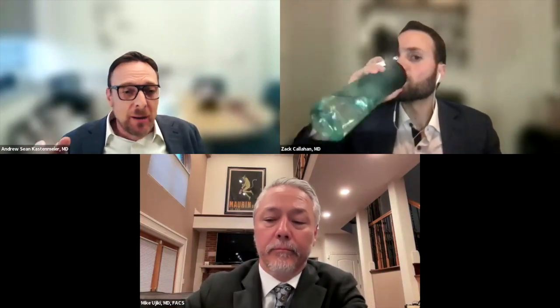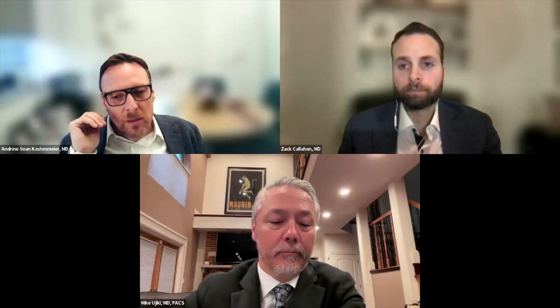Andrew? Yeah, similar. This is probably the most common thing that happens for me, because my initial approach is to go about 1.5 centimeters past the GE junction and to not do full thickness. Then I'll come out and do an EndoFlip. And if it's too low, my moves are to extend it longer and/or go full thickness in that GE junction area. Not for the whole myotomy. You don't need it up higher.